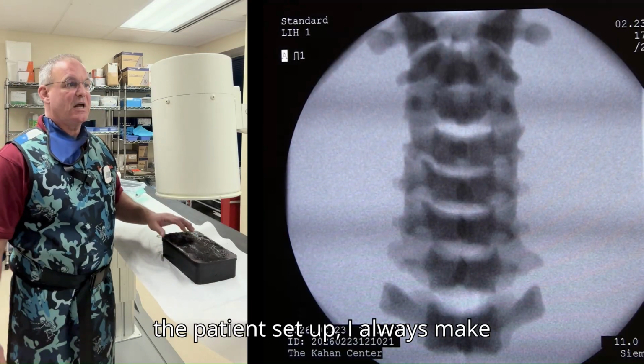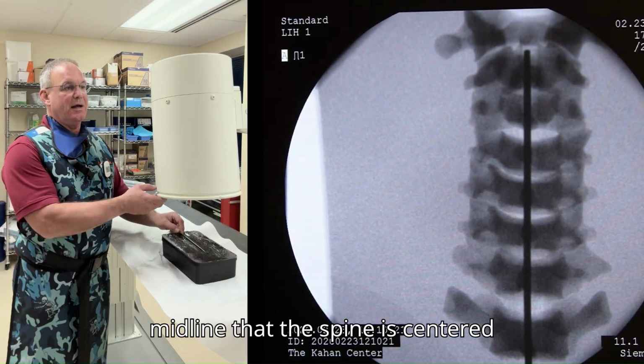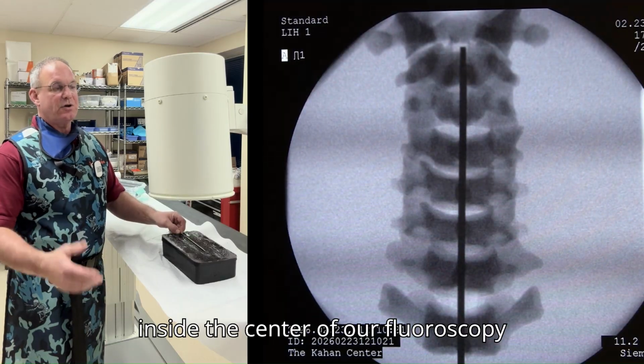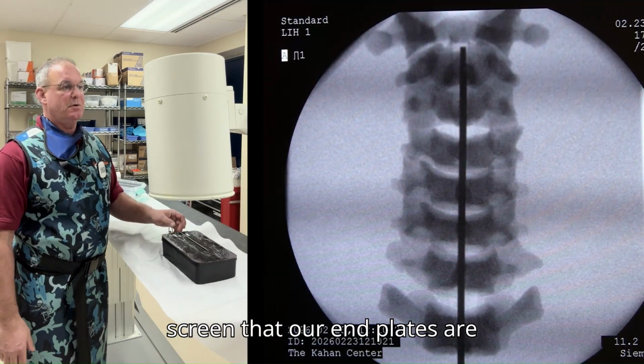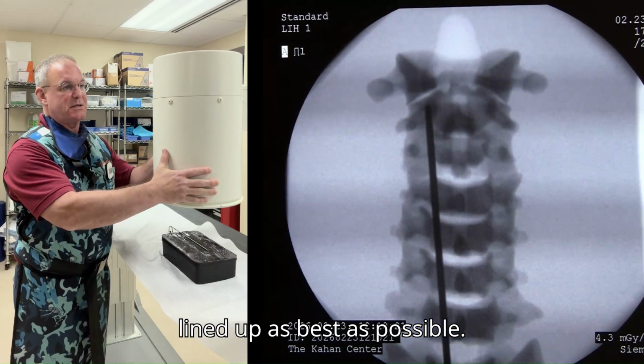When I have the patient set up, I always make sure that the spinous processes are midline, that the spine is centered inside the center of our fluoroscopy screen, that our end plates are lined up as best as possible.